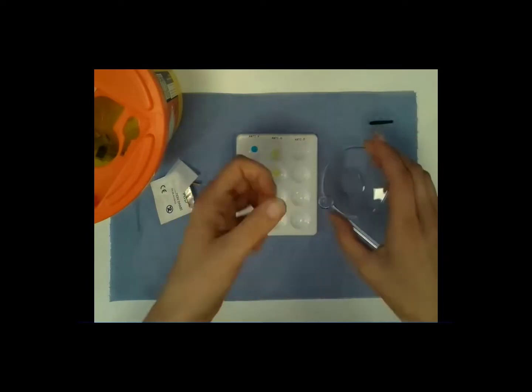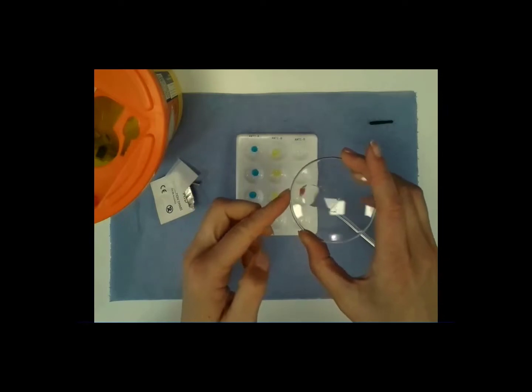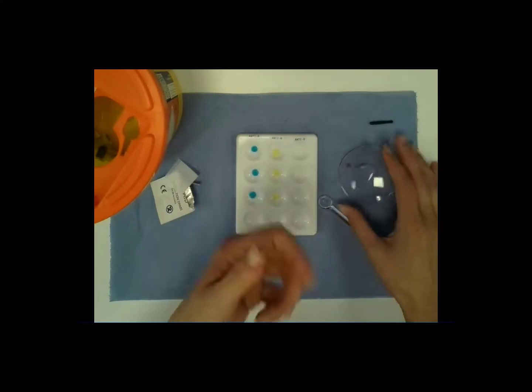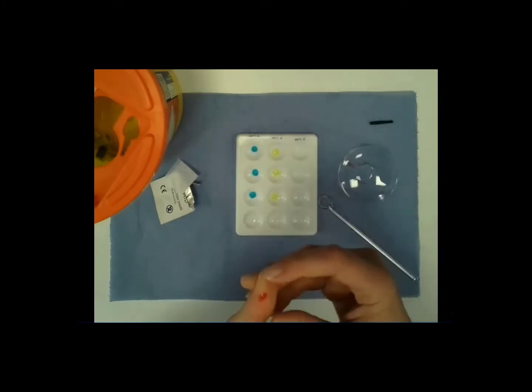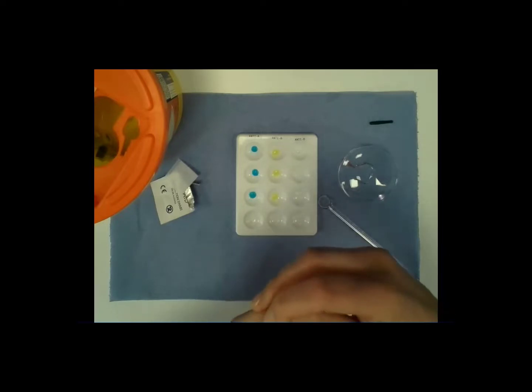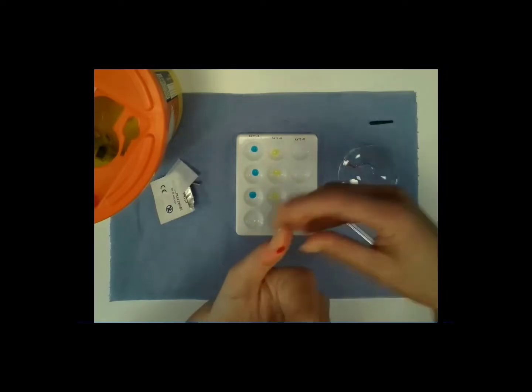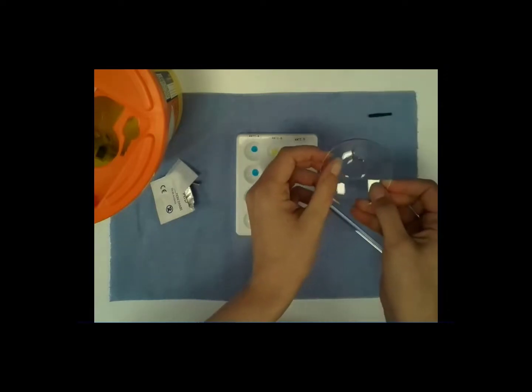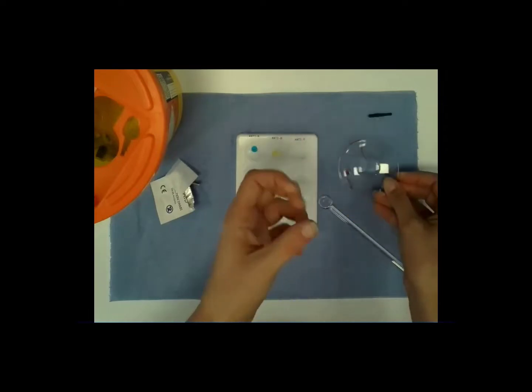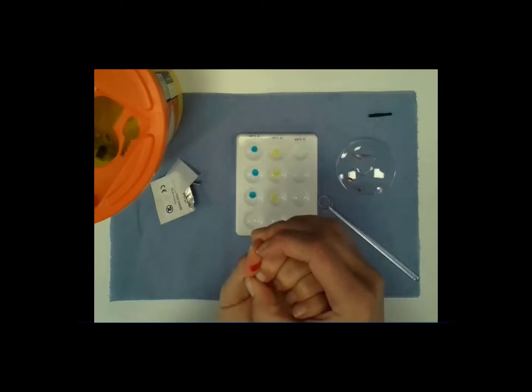Once you've got a reasonable spot, you can touch this to the watch glass. Make sure that you don't touch the fluid and instead tip the watch glass so that the blood mixes with the saline. In this case, I only have a small drop of blood, so I'm going to get 1 or 2 more to make sure that I have enough blood for the practical. If you're bleeding more significantly, 1 spot might be sufficient.